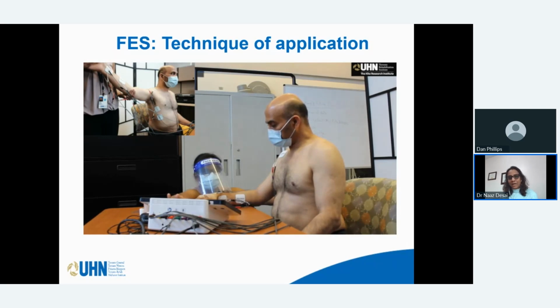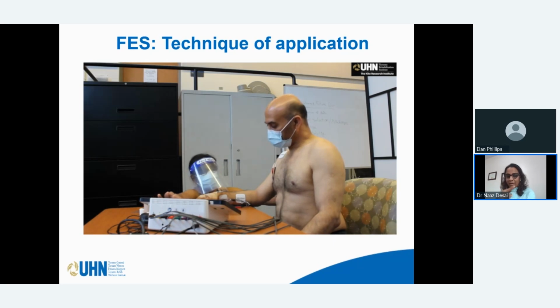And we also constantly ask for patient feedback in this case, because we really want to know if the current is strong enough and if the patient can feel the displacement of the bone, so to say, or the contraction of the muscle, one or the other. So that's how we typically do the intensity setup for muscles that we are only able to palpate and that we are not able to see an obvious movement for. So here I'm setting up the serratus anterior. The screenshot in there showed the electrode placement for the serratus anterior muscle.